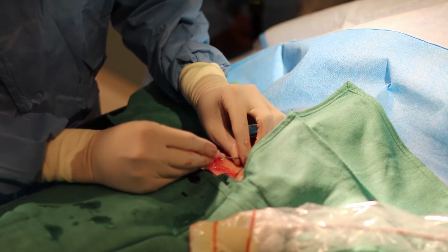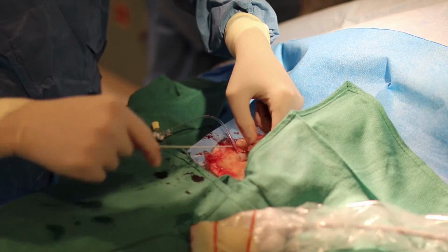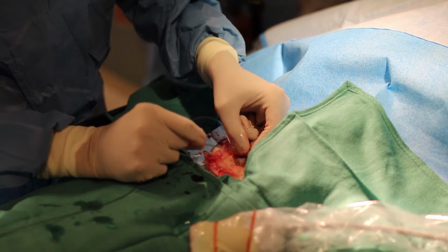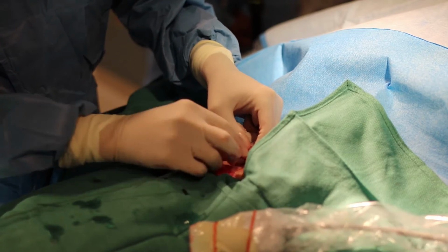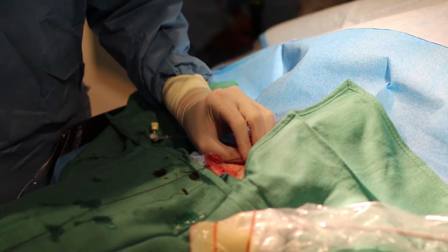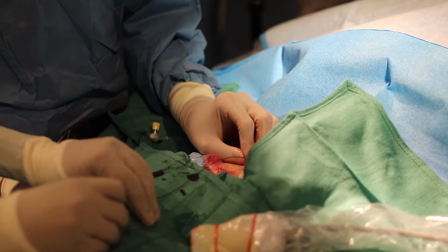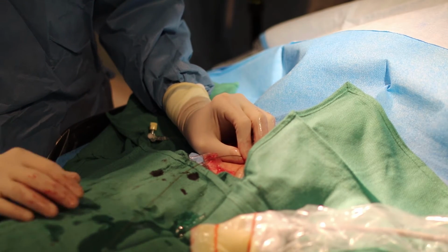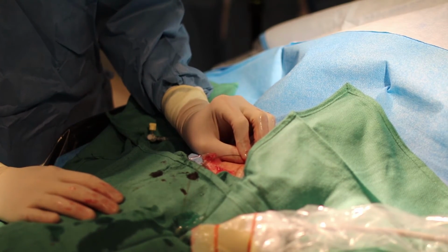It's extremely helpful in patients, particularly patients who are overweight or vessels that are very deep. I think it will substantially reduce your complication rate for both the diagnostic and interventional procedures as well as structural procedures. We do it in every procedure now, just because I think it dramatically improves the safety of the procedure.